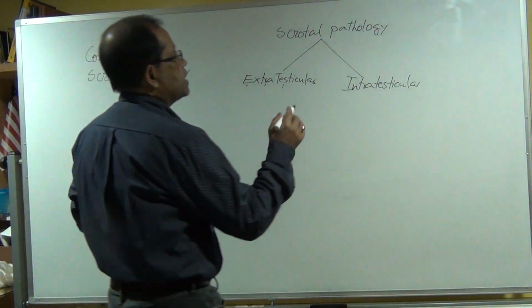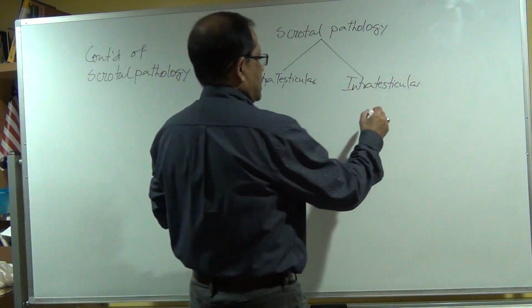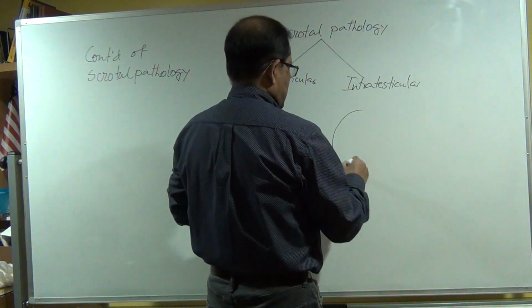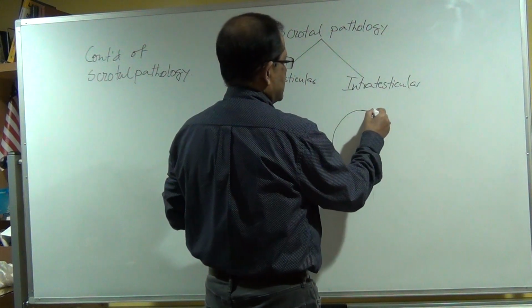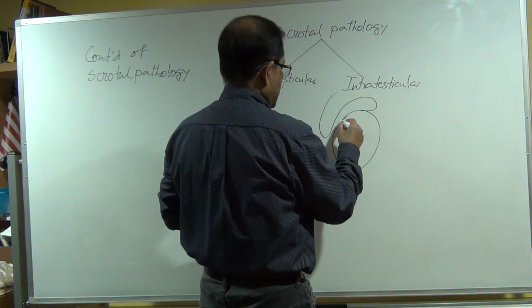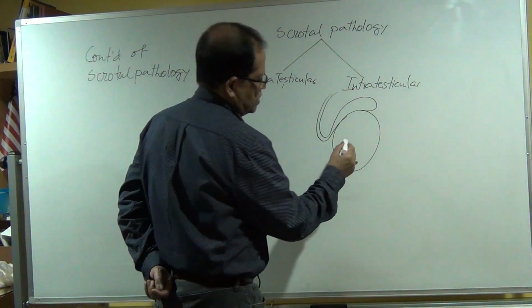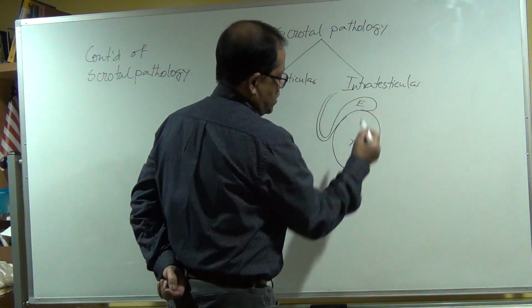Okay, intratesticular pathology means this is a testis, and this is the epididymis.